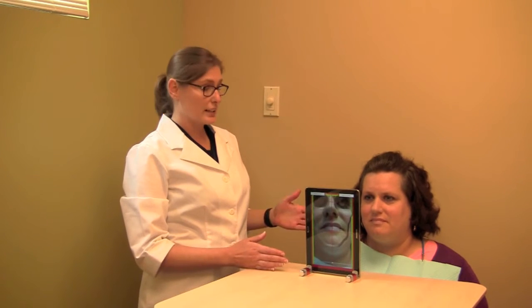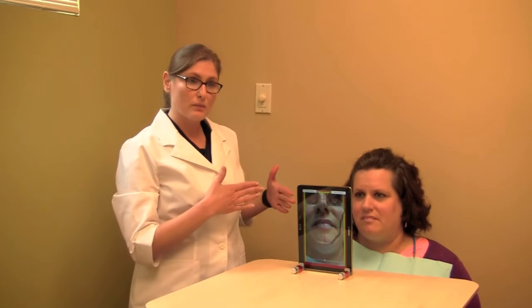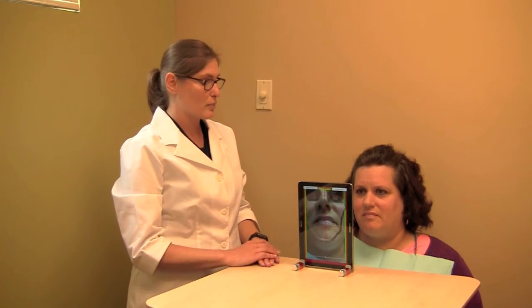So our next step is to position Max along with Vanessa. We want to make sure that Max is going to be parallel to Vanessa, so patient positioning is very key. She needs to be relaxed and looking straight ahead like she was looking into a mirror. The other thing I've taught Vanessa how to do is to use her retractors, so that way she will be able to place them without me having to touch her mouth.